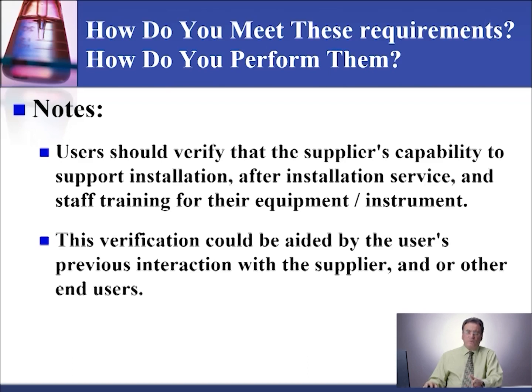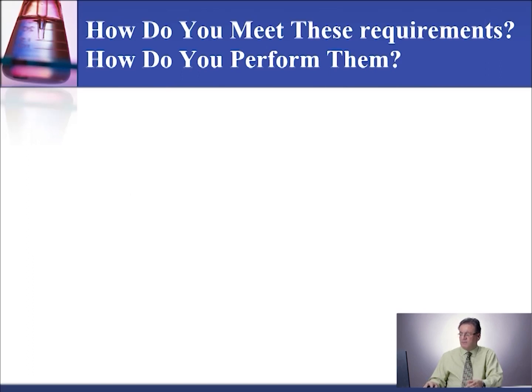If the results of the PQ are satisfactory and acceptable, then the equipment or instrument can be released and used for patient testing and resulting. As needed, any deviation observed during the PQ stage from the lab SOPs, or if the result of any of the qualification stages were unsatisfactory, not acceptable, or not done, it should be recorded, investigated, and solved before you can use this instrument for patient testing.